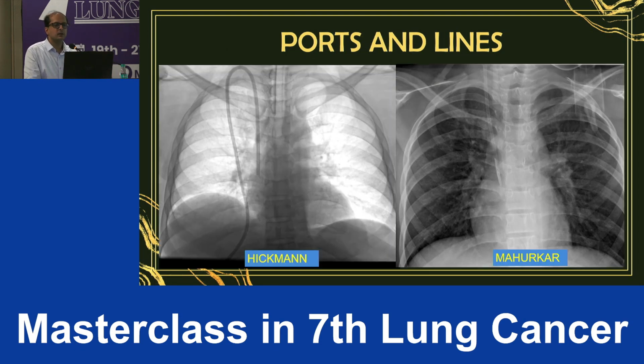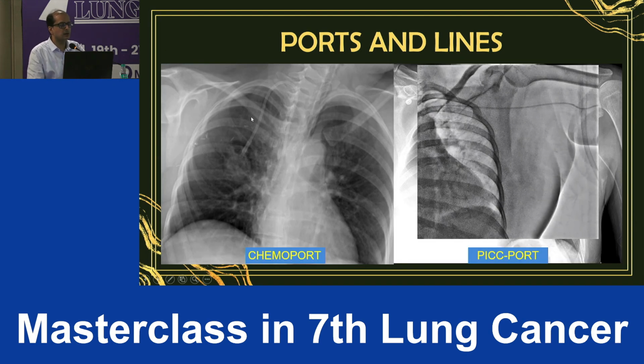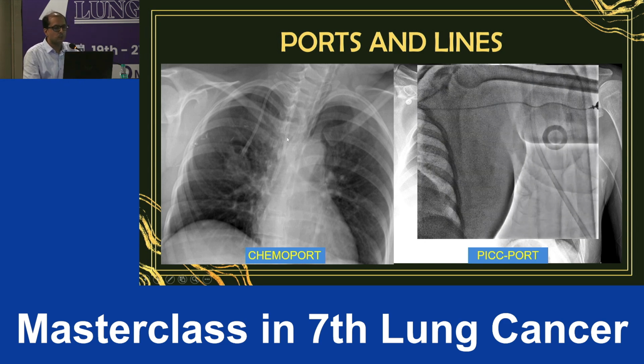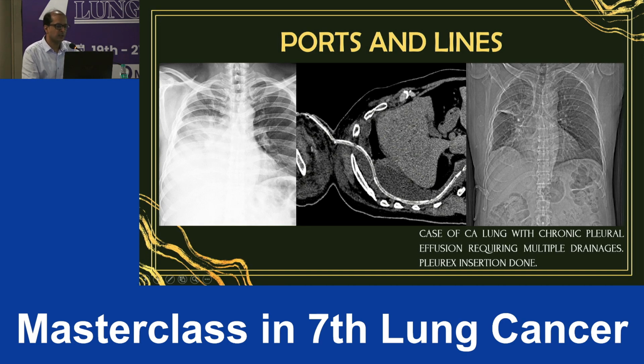Another thing is ports, port placement. So this is the tunnel Hickman catheter. These are tunnel catheters, and these are non-tunnel catheters. If the chemotherapy or the transfusion needs to be given for a longer time, tunnel catheters are preferred over non-tunnel. Again, while giving chemotherapy, pre-chemotherapy, the port can be placed, and a PICC line if no other access site is available.